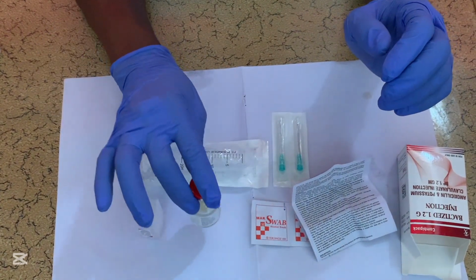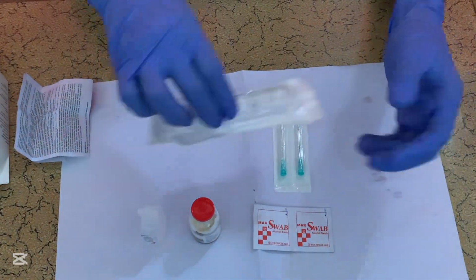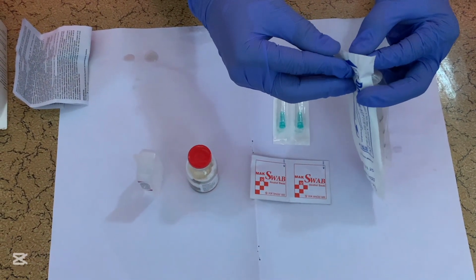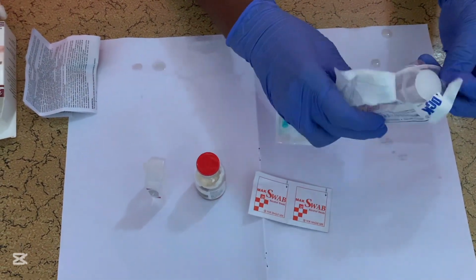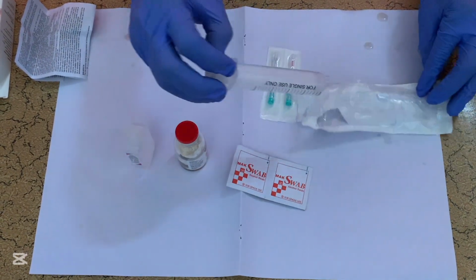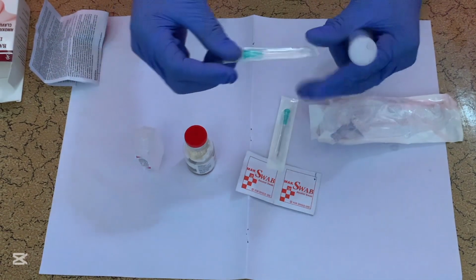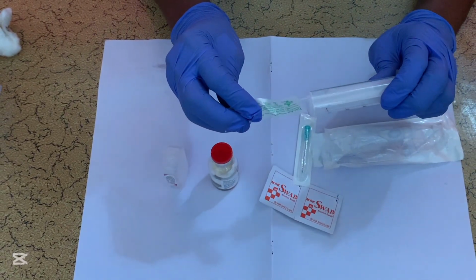Okay, let us now start. Then what you do, make sure you get the syringe. Then you open it from the packaging. Make sure you remove the syringe from the packaging. Then you get a 21 gauge needle, and you attach the needle to the syringe.